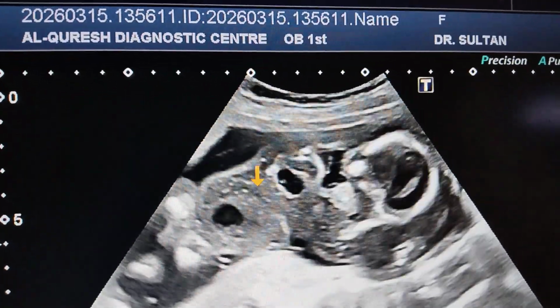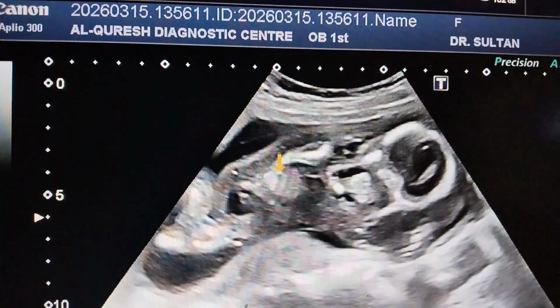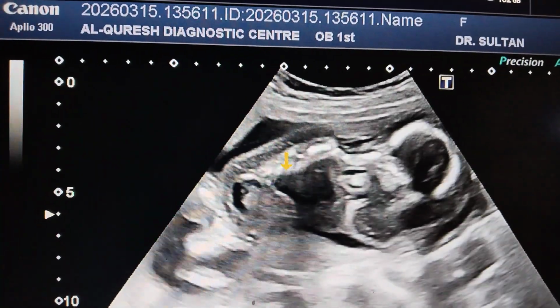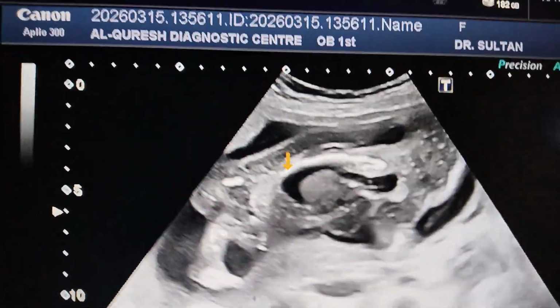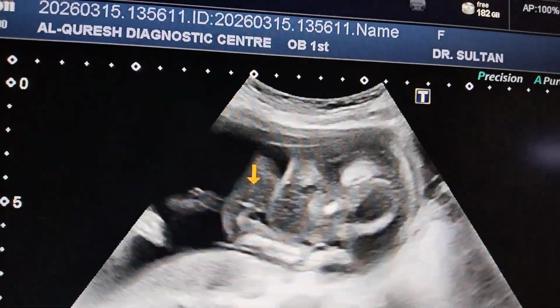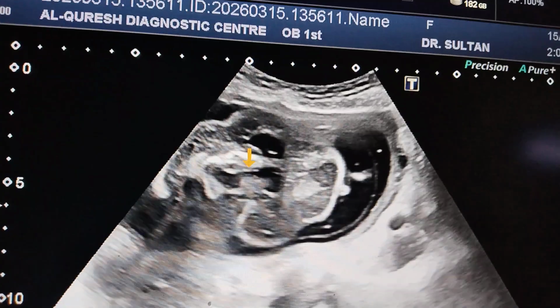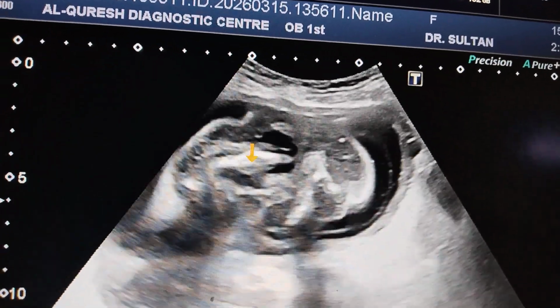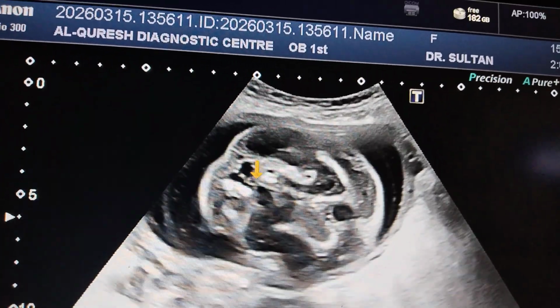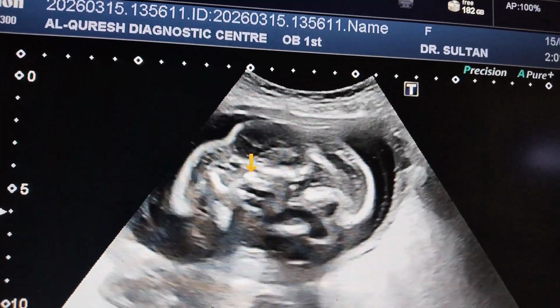Number one, skin subcutaneous edema. Number two, pleural effusion. Number three, pericardial effusion. Number four, ascites. So these should be present. Almost two or more than two should be present when we are labeling the fetus as hydrops fetalis.